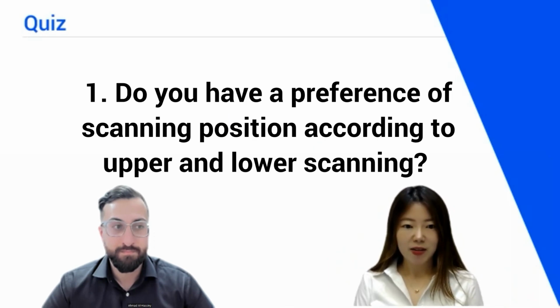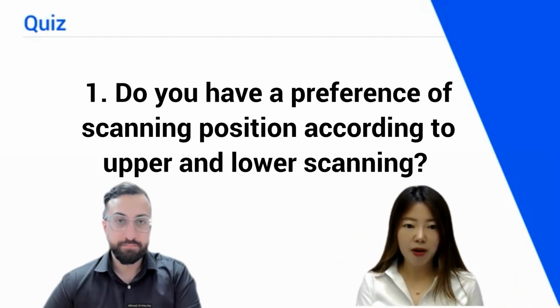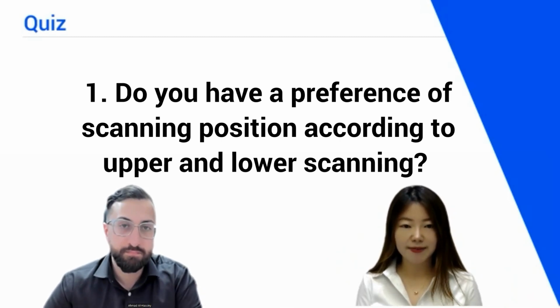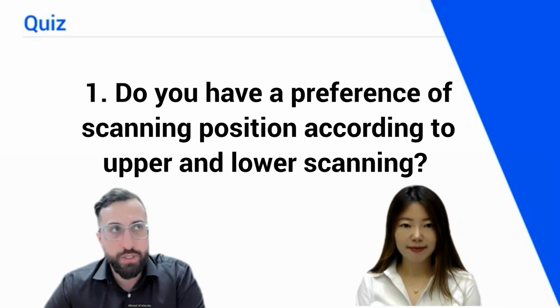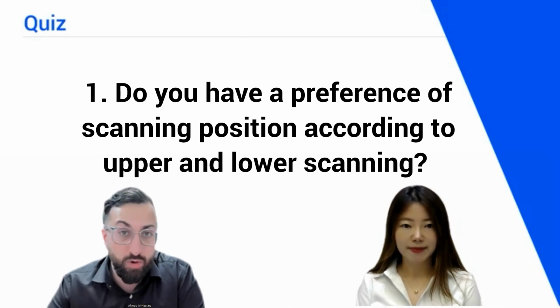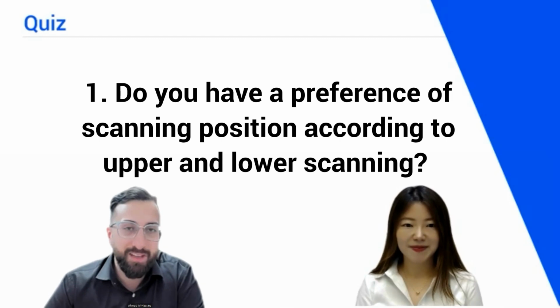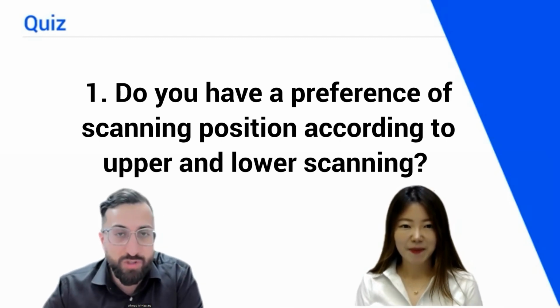Question number 1. Do you have any preference of scanning position when you are doing upper and lower arch scanning? That's a good question, and that really comes into almost personal preference. So I actually stand when I do all my dentistry. I know that might be a little bit crazy, but something that I've kind of just gotten used to.